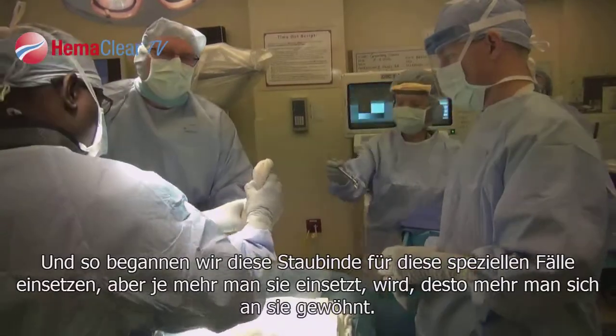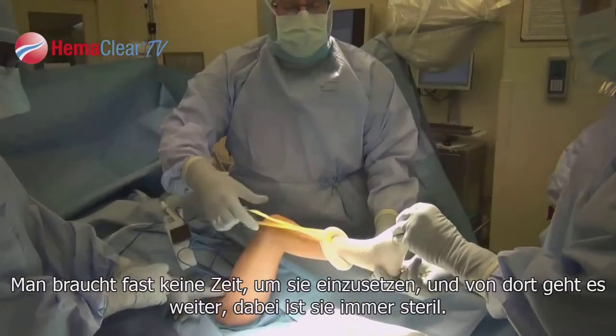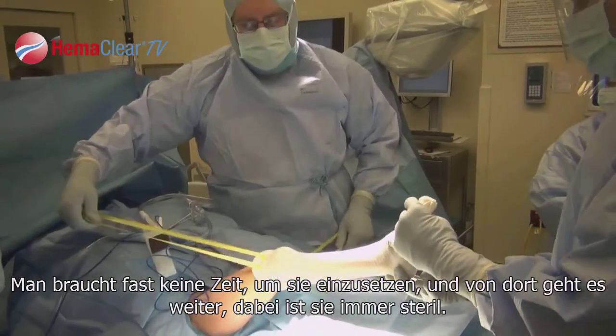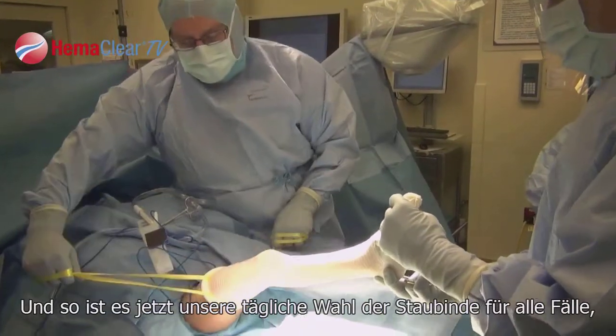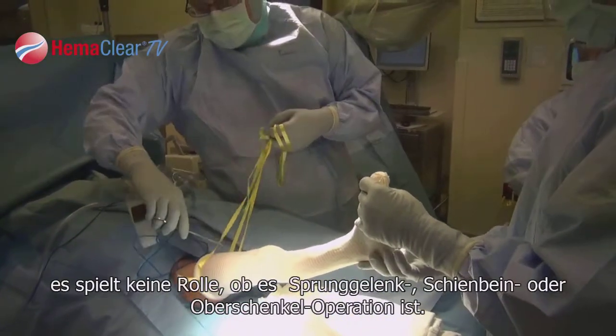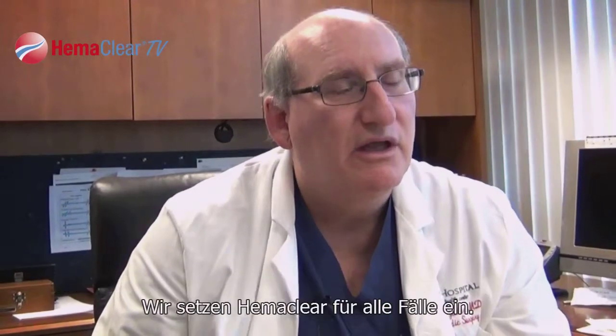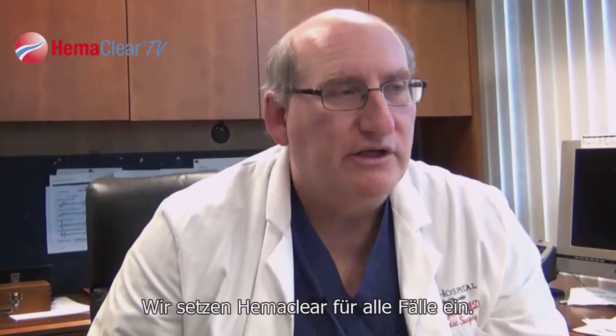We started using it for those special applications, but the more you use it, the more you get used to it. It's so quick to just put it on, and it's always sterile. Now it's become our everyday tourniquet of choice for all cases — ankle surgery, tibia surgery, or femur surgery — we use the HemaClear for all cases now.